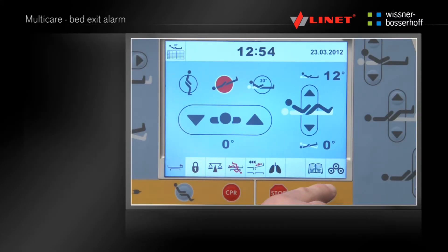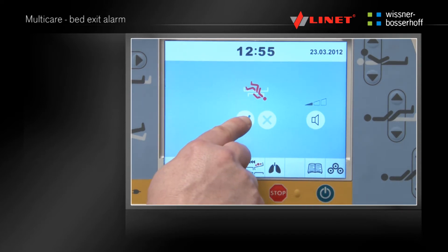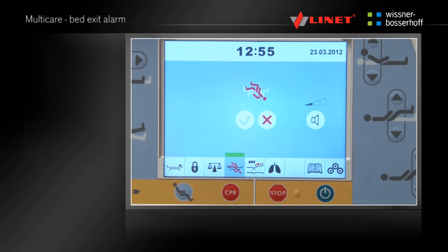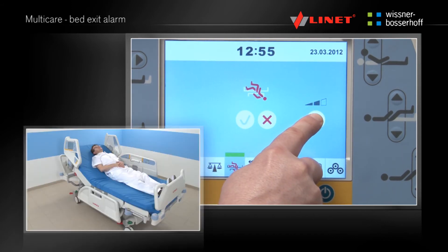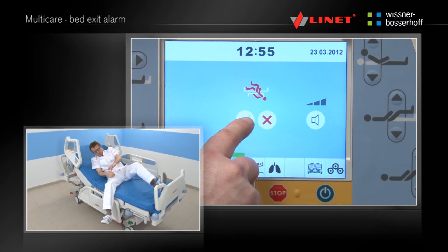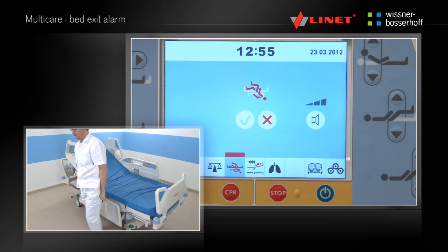Press the Activation Go button. By pressing the respective button the bed exit alarm menu can be accessed. Turn the bed exit alarm on by pressing the green OK button. The volume of sound can be adjusted by the klaxon button. If the volume is in the lowest position the sound alarm is muted. If the patient leaves the bed the alarm will sound and graphical signalization occurs. Deactivate the bed exit alarm by pressing the X button.